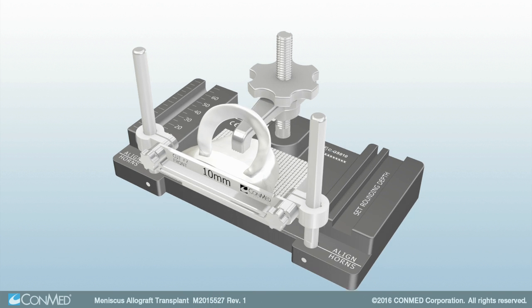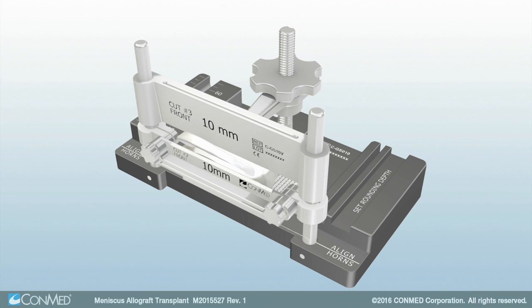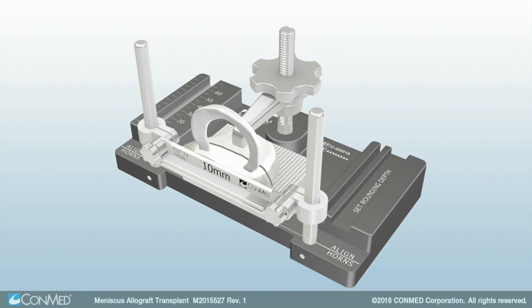Next, place the vertical fence over the guideposts so the etching that reads Cut No. 3 faces the front of the graft station. Ensure the meniscus is clear from the cutting fence. Perform the final cut, then remove both fences.